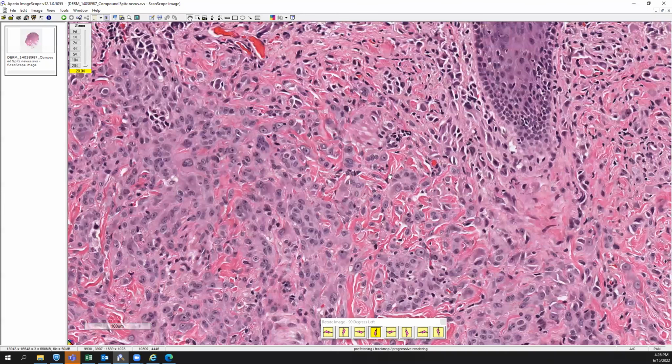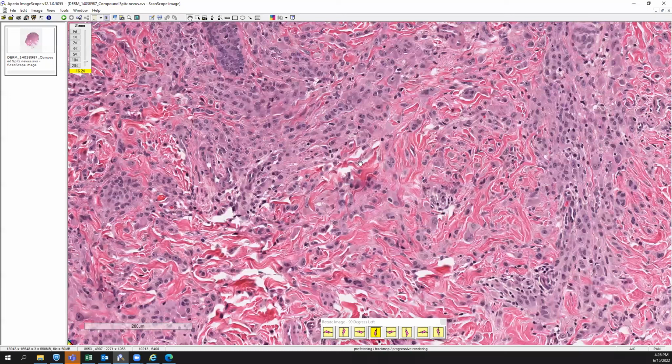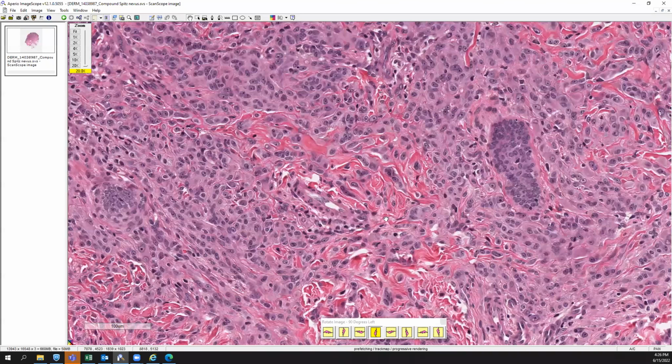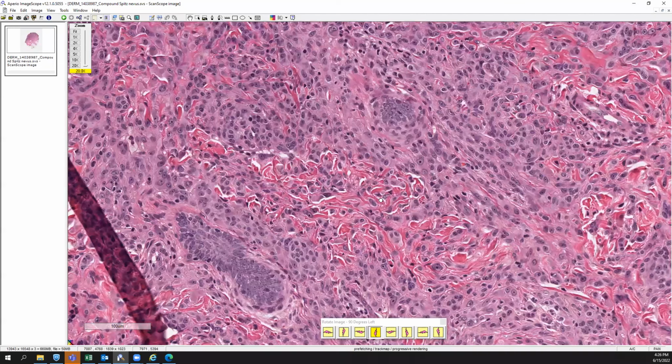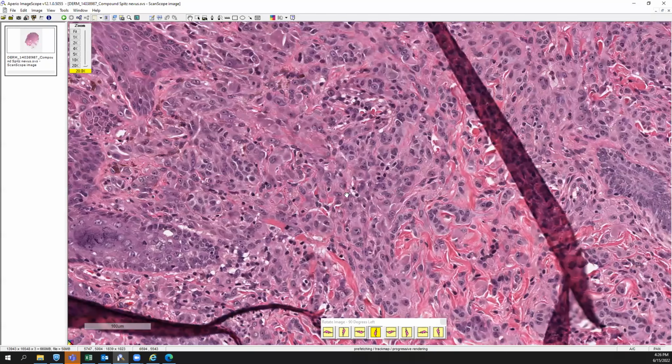You should get worried about anything greater than 5%, approaching 10%. It's nice to visualize the proliferative activity of a lesion such as this. Typically these lesions are clinically growing in a young patient, so you definitely want to make sure the proliferation rate is low at the time of the sampling.